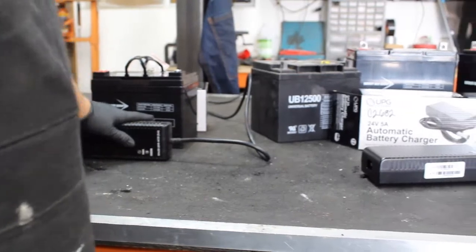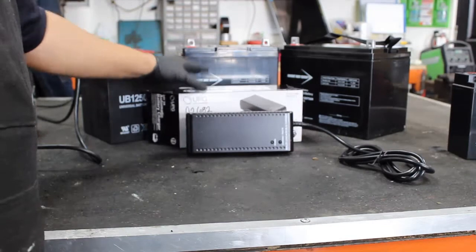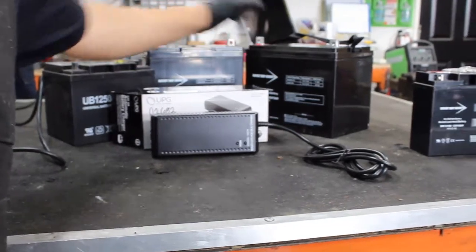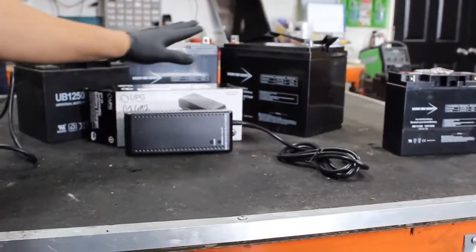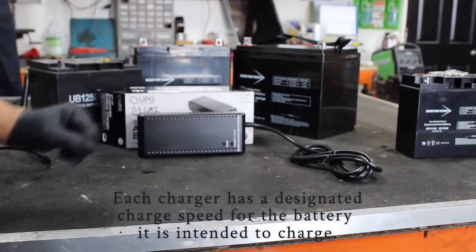Now we're going to a larger charger. This charger is meant for a very large battery — the 1250, 1255, and 1275. This charger is meant for those. That will charge it a little faster, but it's meant for that speed.